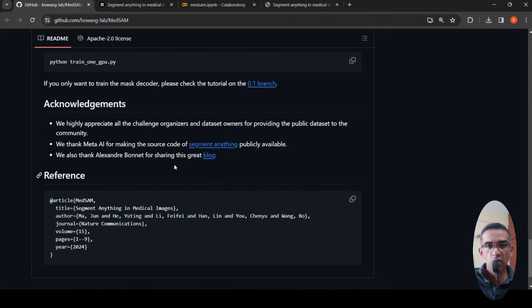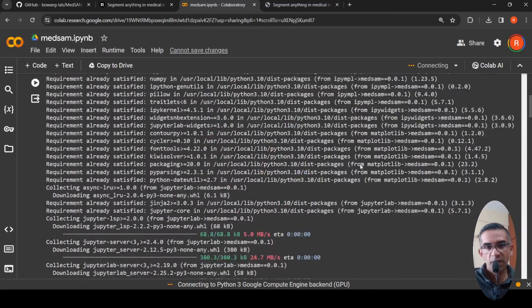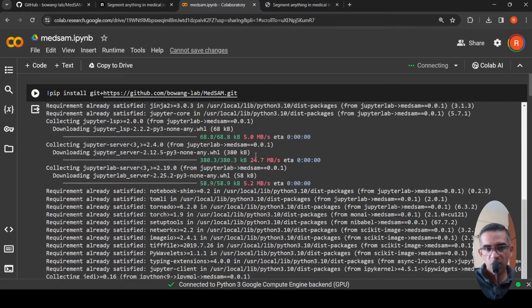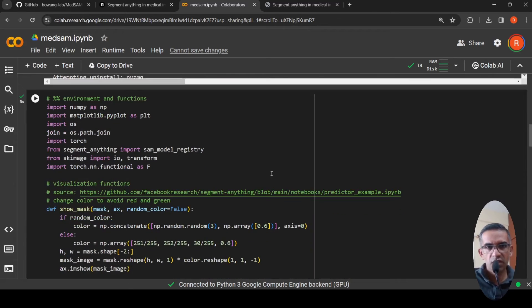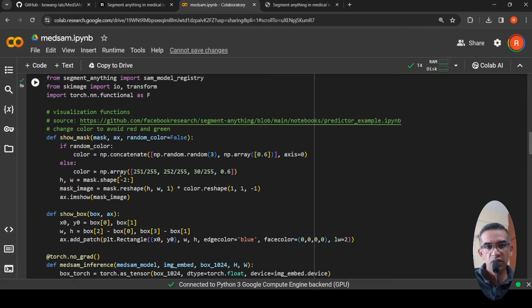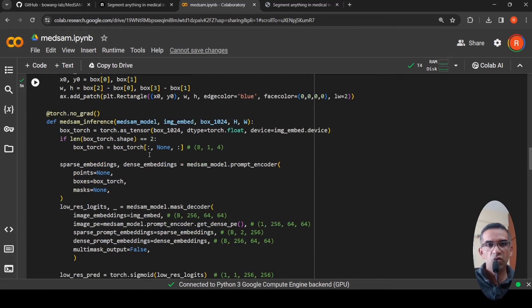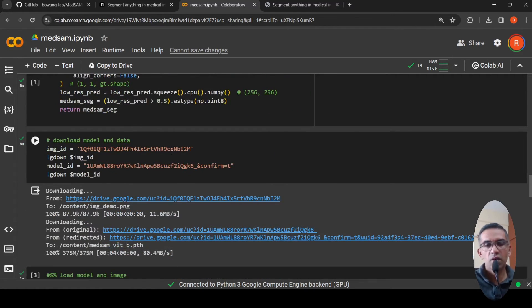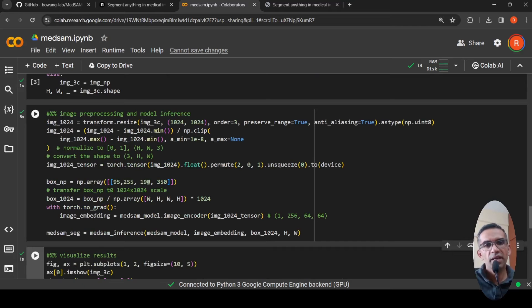They also have a Colab notebook you can try. It explains how to install MedSAM from GitHub, with visualization functions for bounding boxes and results, an inference function, and instructions for downloading the model and data, loading the model, image pre-processing, and visualizing results.